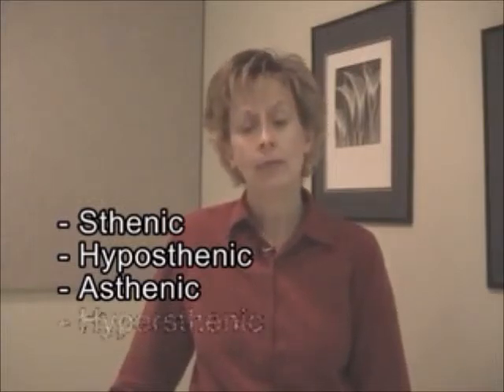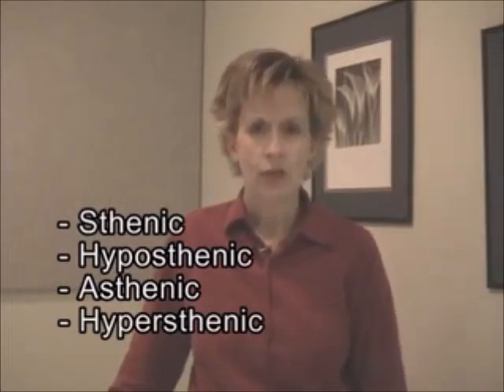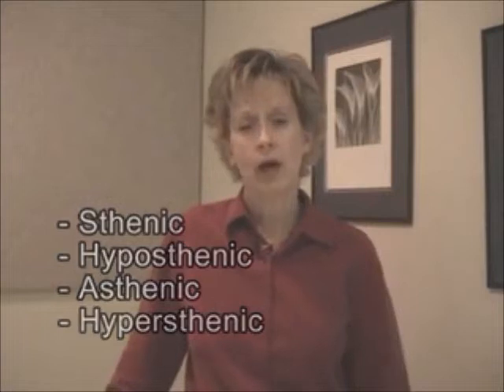And then you have the hypersthenic, which is an obese type of patient. So again, 4 different types of body habitus, sthenic being average, hyper being excessive to normal, hypo just under average, and asthenic is very, very tiny. So when I do the demonstration today, I will be emphasizing those different body habituses.